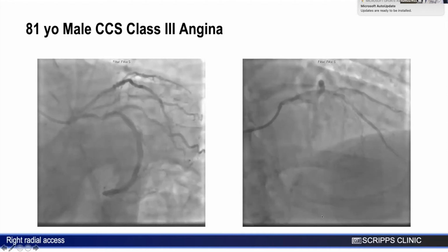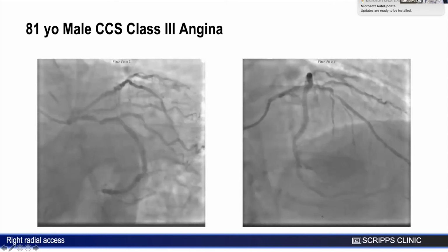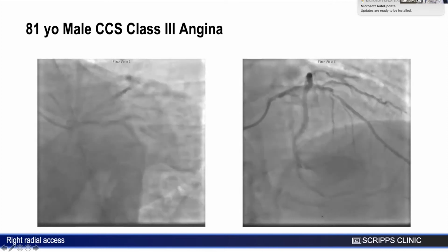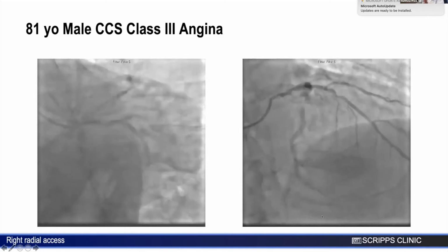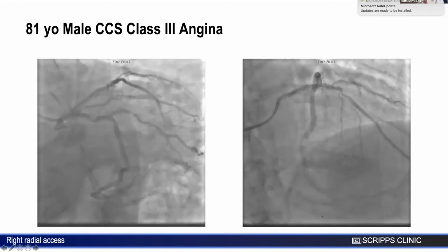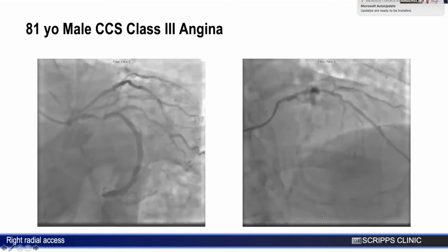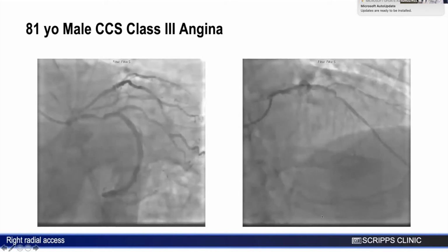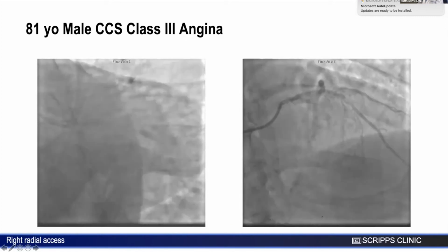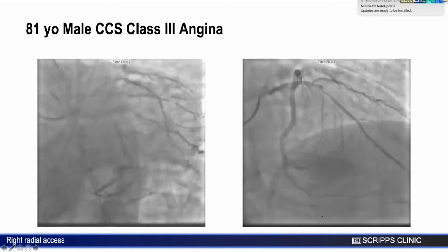So here's your angiogram. I get called into the lab. Hey, Matt, will you fix this for me? So offhand, you can see there's an ostial LAD lesion, right? There may be something in the proximal circ, or I guess that's the mid circ, after the first OM there. There is maybe a question of some mid LAD disease. It looks pretty bad after the diagonal, no? Yeah, it does. All right.